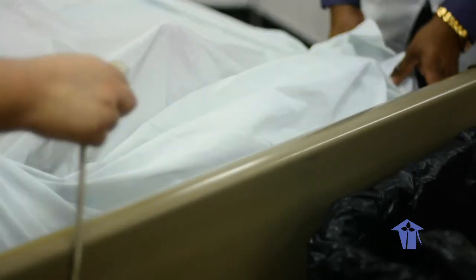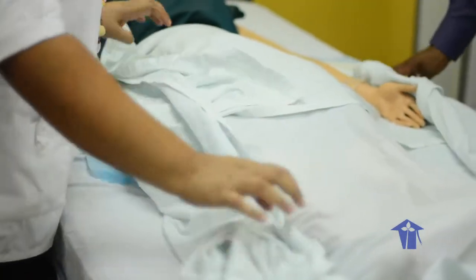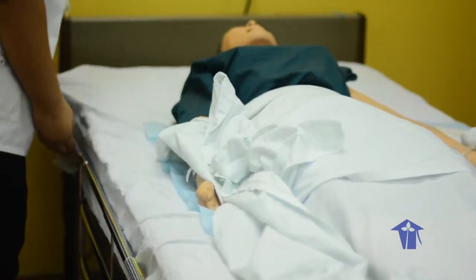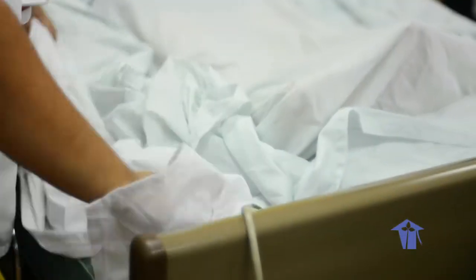When taking off the sheet, we try not to flicker the sheet because obviously you will have a lot of dead skin and so forth, okay? So we're going to keep the patient's privacy at this time. So we're going to just take off the sheet, right?